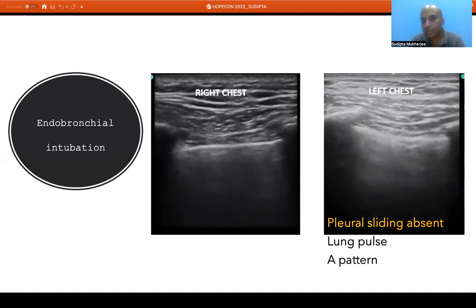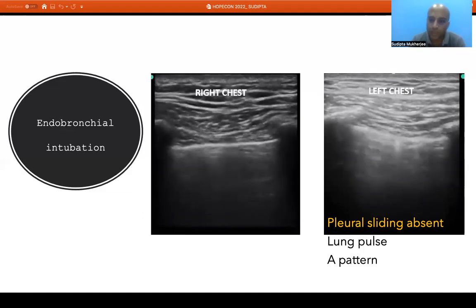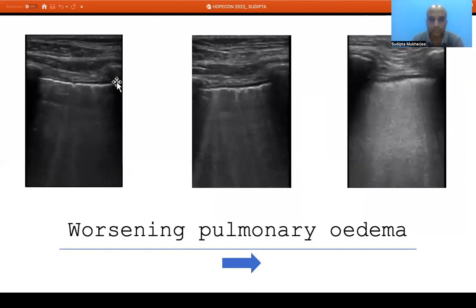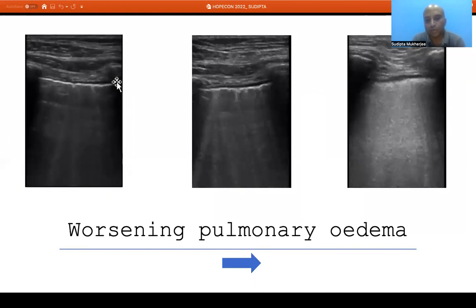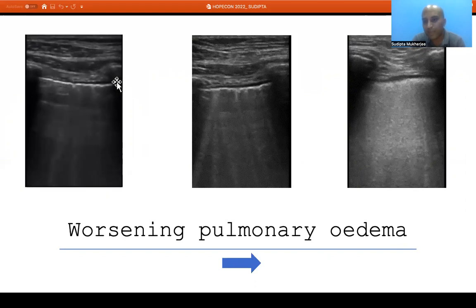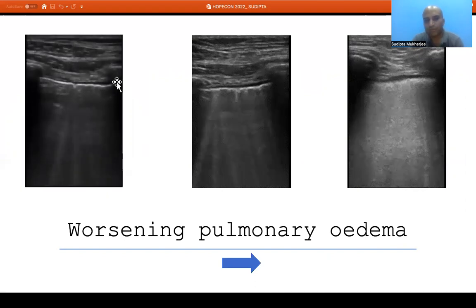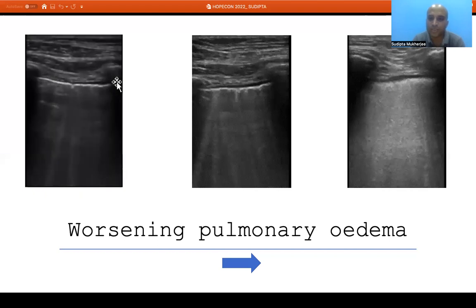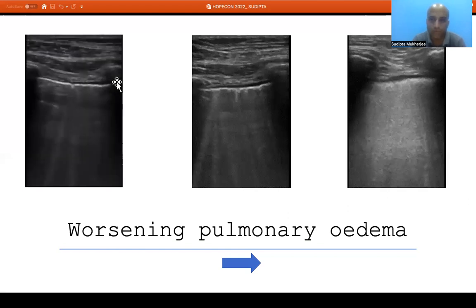Once we find these findings we are sure there is endobronchial intubation. We can also monitor the patient with lung ultrasound in terms of severity of pulmonary edema and its clinical effects. From a picture showing a few B lines to the subsequent picture showing confluent B lines, we can clearly see that deaeration has worsened. If this happens during resuscitation, it means the patient is developing more pulmonary edema and we probably need to restrict our fluid management.